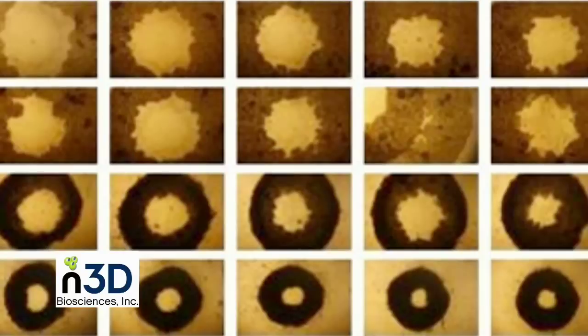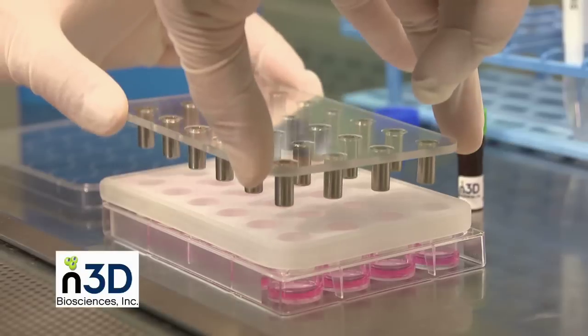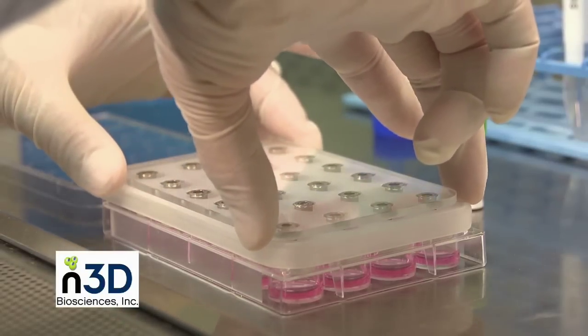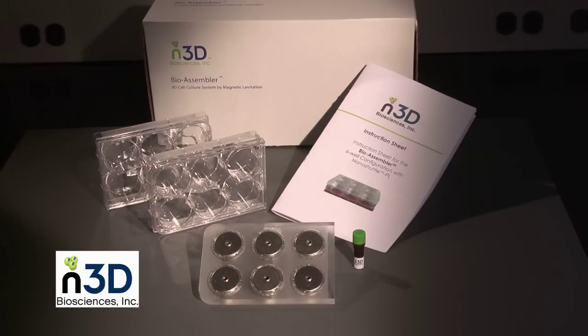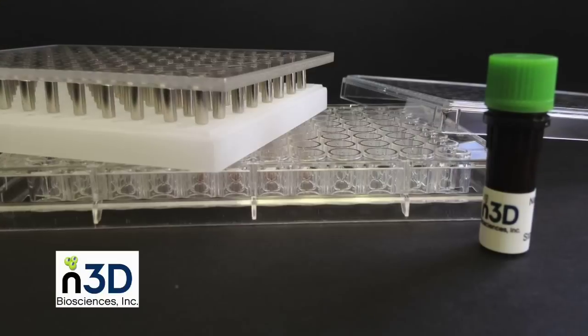No artificial gels or scaffolds are used, and no expensive equipment is required. Versions of the BioAssembler are available in single-well, 6-well, 24-well, and 96-well formats.